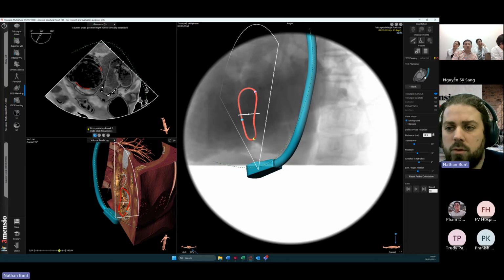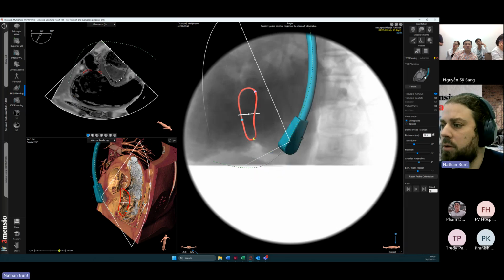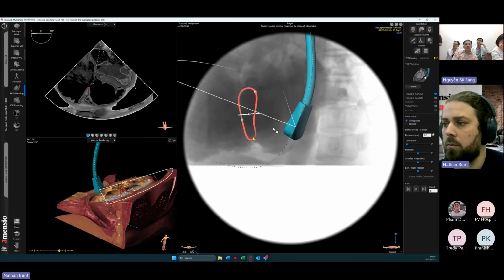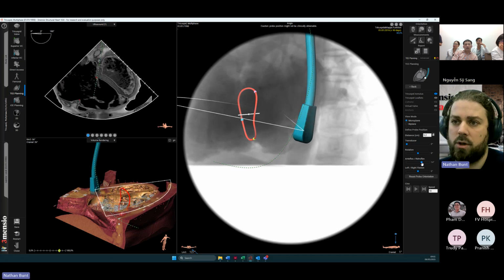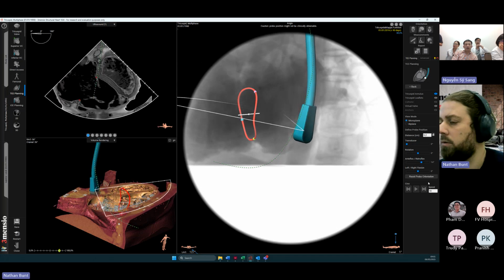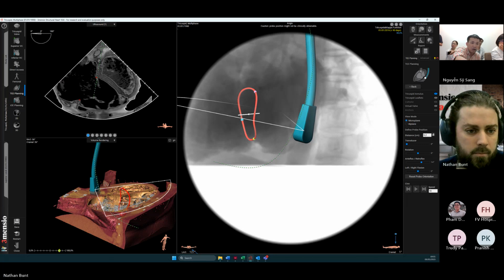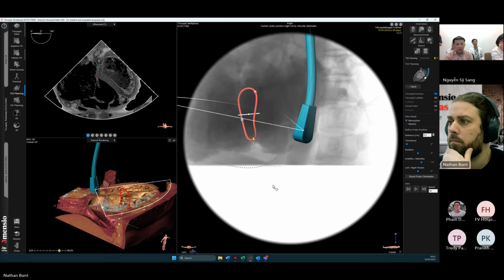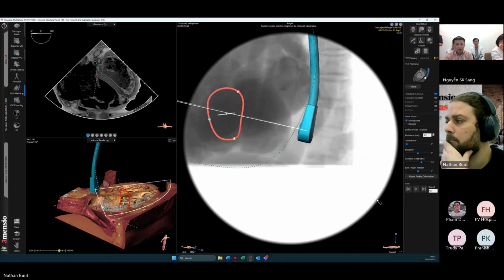We can save up to 10 of these angulations by clicking on the plus sign. So transgastric, but also, of course, esophageal views can be used. Again, in this case, for example, providing a cross-sectional view of the heart. Any questions here?